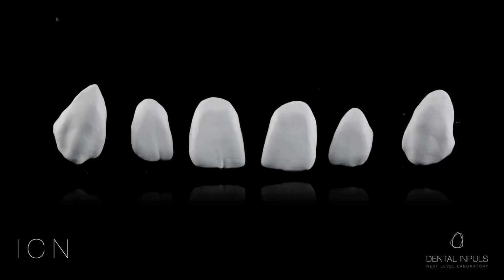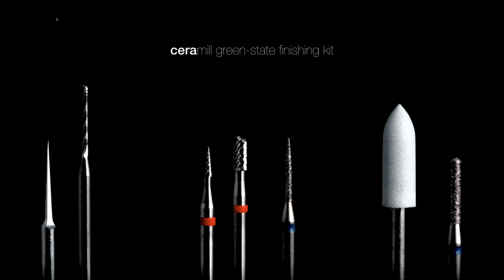So after milling, only the shape is preserved, and that is the most important element. So step 2. These are the tools that we use for manual rework of zirconia in white state. It is the green state finishing kit by Amann Girrbach. We use them to achieve surface structure. During the refinement process, it is very important to work with less pressure to prevent the possibility of damaging the material.